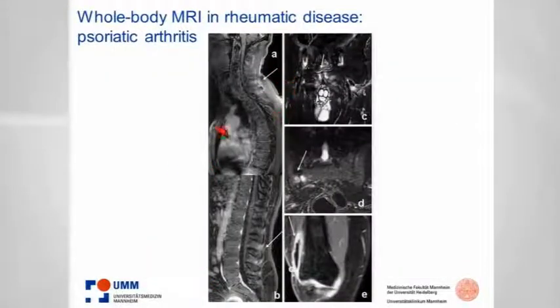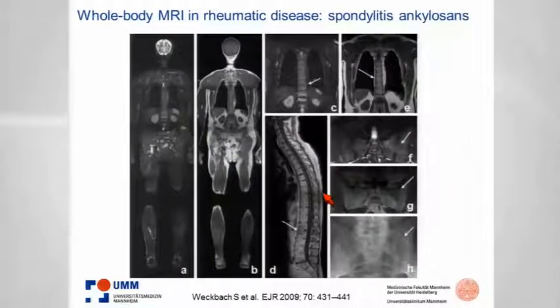It's even more impressive here. You see the typical enthesitis interspinal, you see the one-sided sacroiliitis, and you see the synovitis all together with this enthesitis here of the symphysis together, involving also the tendons of the adductor muscles. So I think this is a really very nice approach, and particularly for those disease-modifying anti-rheumatic drugs like TNF-alpha. It's very important because they're really expensive, that you have a very objective assessment of the disease monitoring.